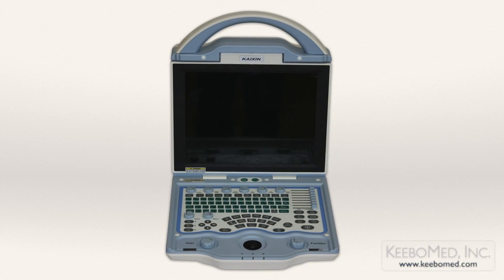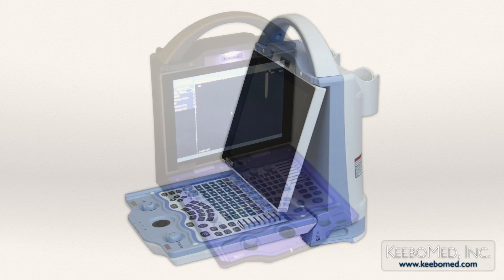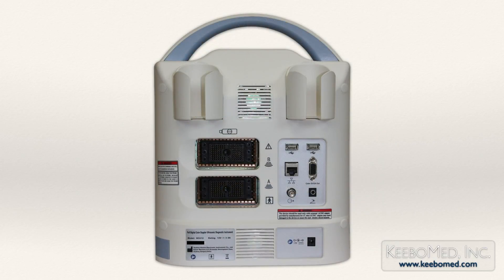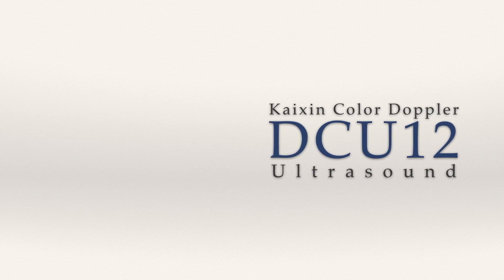The DCU-12 color Doppler ultrasound has proven to be a perfect choice for many because of its high quality, extensive features, and affordable price. It also includes a two-year warranty. For additional information or to purchase the DCU-12 color Doppler ultrasound, visit our website at kibomed.com.